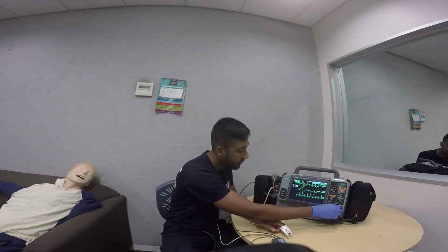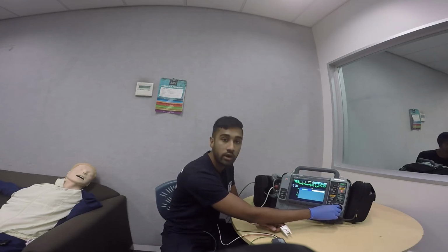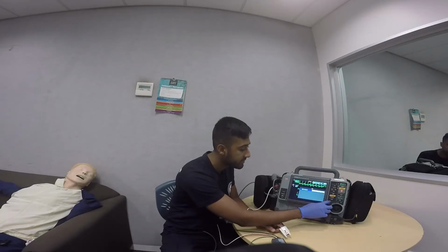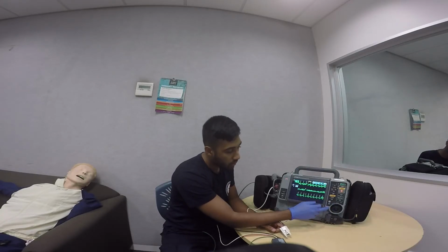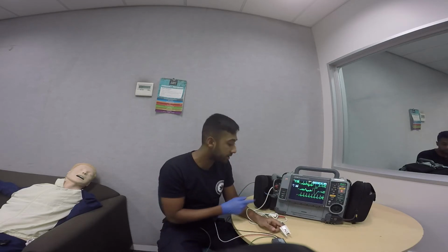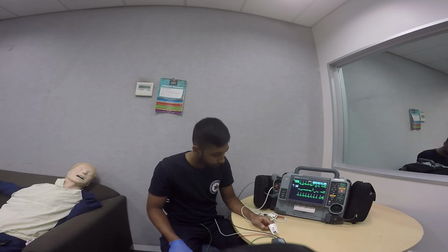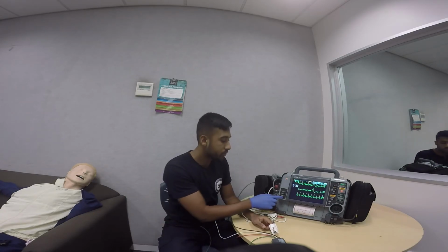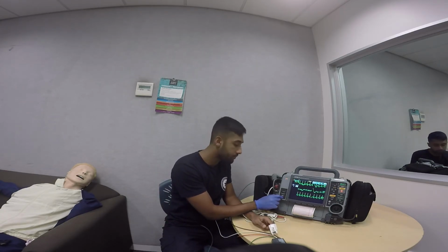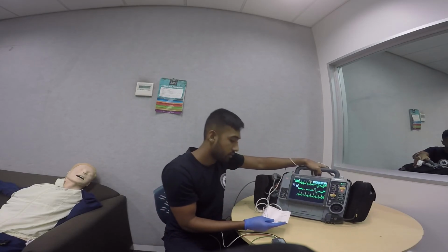To change our QRS volume, we'll scroll onto the heart rate, select the QRS volume and raise the volume to whatever we need. We also have the non-invasive blood pressure button here, and we can also print out an ECG by pressing print on the LifePack. Once we're done, we can just press print again and it should stop, like so.